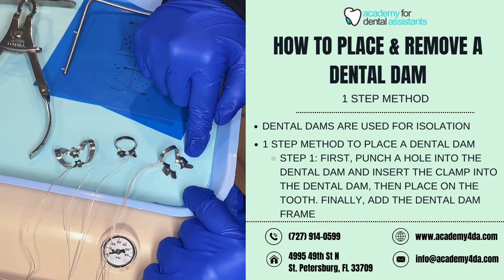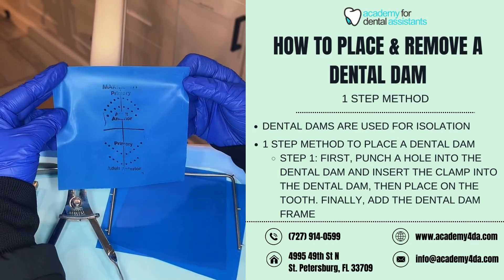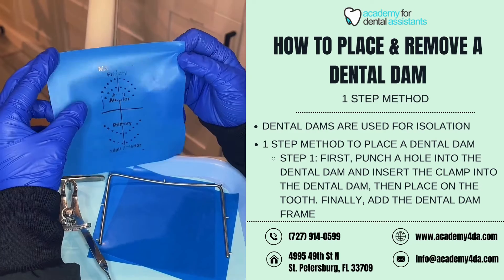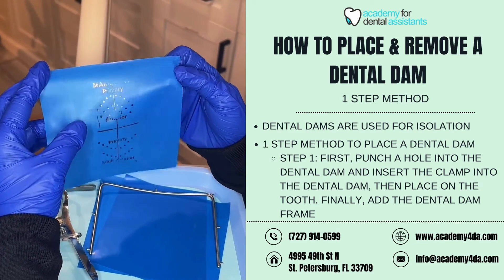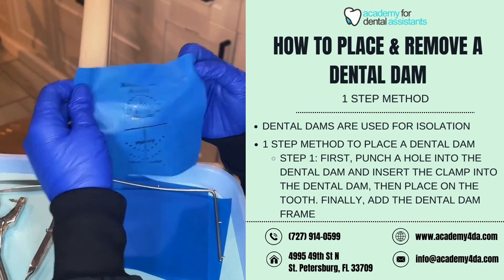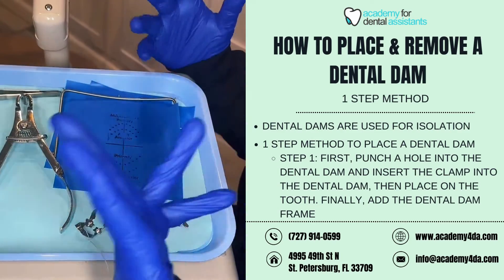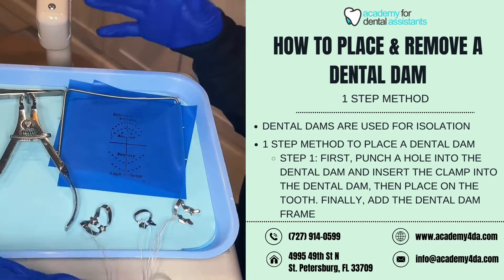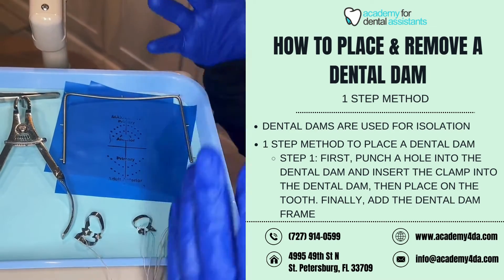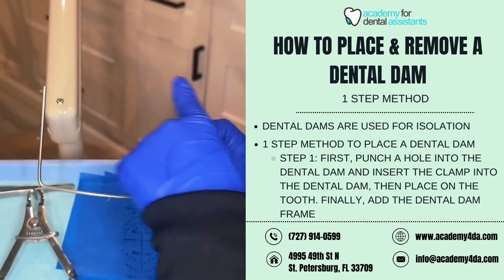This here is our premolar clamp, and this one here is our molar clamp. This here is our dental dam, which has a stamp on it. You will punch a hole with the dental dam punch into this dental dam to fit around the tooth. Dental dams are used to help isolate a tooth, a few teeth, or a quadrant when a dentist is performing a procedure.